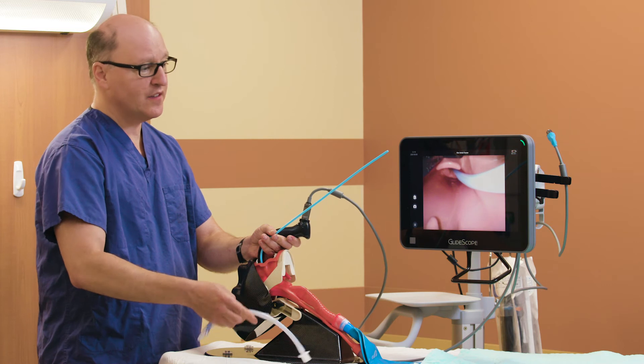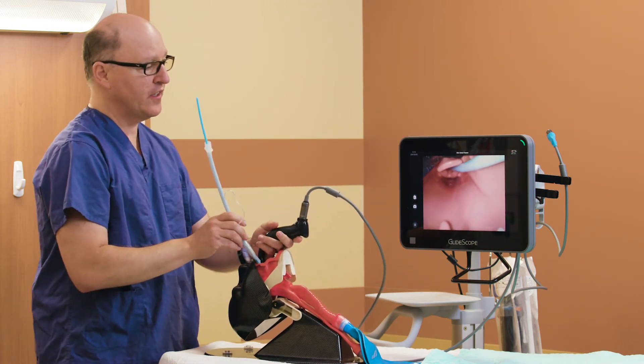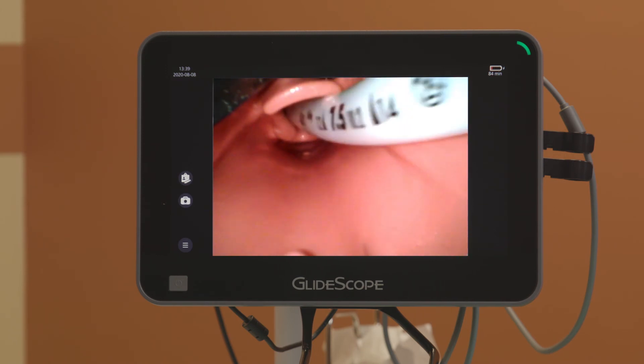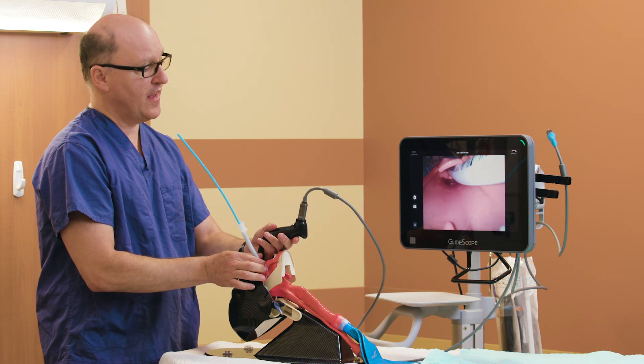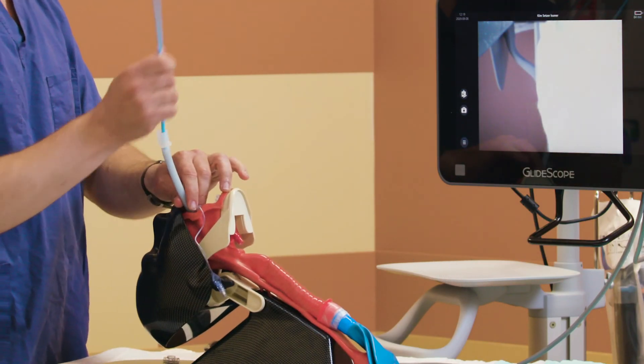I take the tracheal tube and railroad it over the bougie. On insertion, as I approach the larynx, I give the tracheal tube a hard left or counterclockwise twirl. I enter the trachea and now I can stabilize my hand at the right depth, which is 23 in this mannequin. I back out the blade and I can take out the bougie.